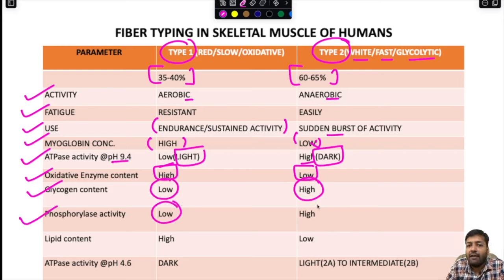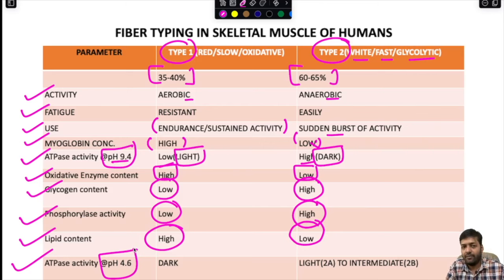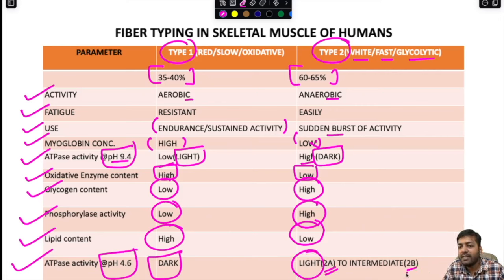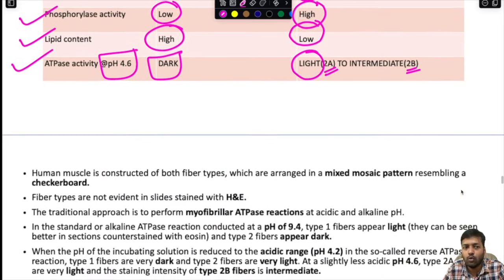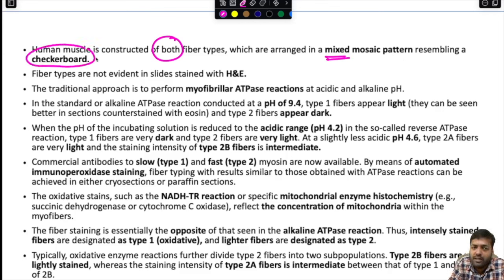ATPase activity at alkaline pH 9.4 is low for type 1 (appearing light) and high for type 2 (appearing dark). At acidic pH 4.6, this is reversed: type 1 fibers are darker and type 2 fibers are lighter. Type 2 is further divided into 2a (light) and 2b (intermediate between type 1 and 2a). Fiber typing is not possible on routine H&E staining — special stains are required.